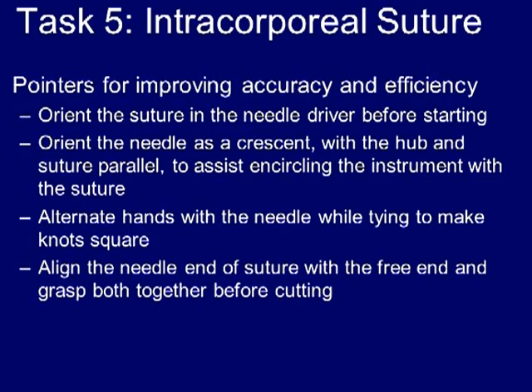And finally, to complete the exercise, it is helpful to leave the free end of the suture ungrasped and then bring the end of the suture that has a needle still connected to it over to align with the free end of suture, and then grasp both of these before cutting to complete the exercise.